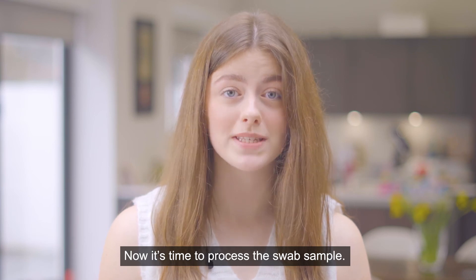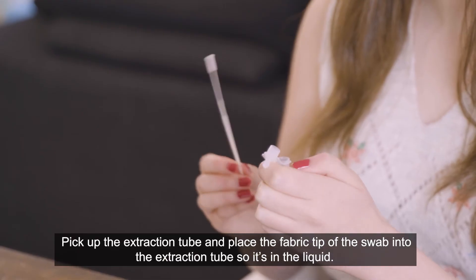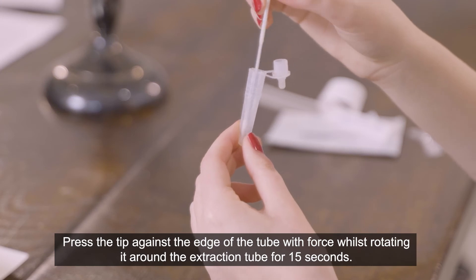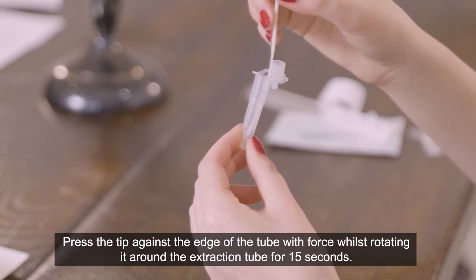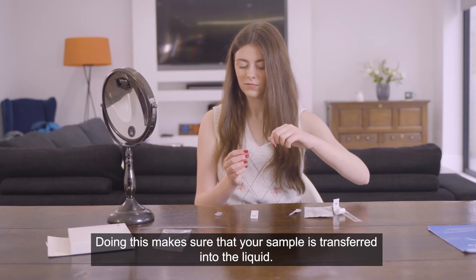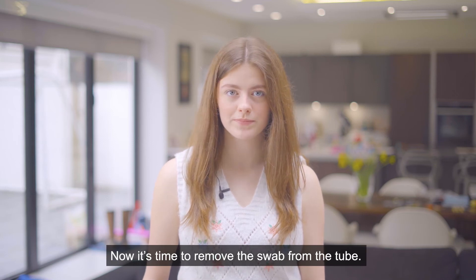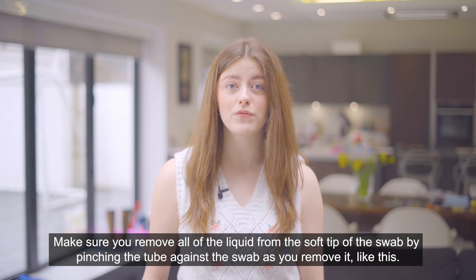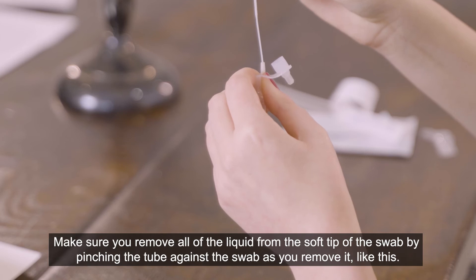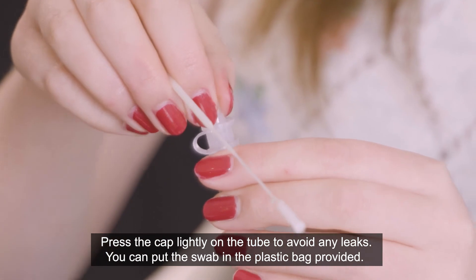Now it's time to process the swab sample. Pick up the extraction tube and place the fabric tip of the swab into the extraction tube so it's in the liquid. Press the tip against the edge of the tube with force whilst rotating it around the extraction tube for 15 seconds, making sure that your sample is transferred into the liquid. Remove the swab from the tube, making sure you remove all of the liquid from the soft tip by pinching the tube against the swab as you remove it. Press the cap lightly on the tube to avoid any leaks.